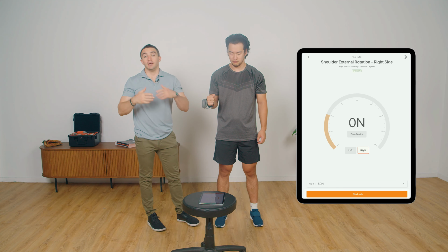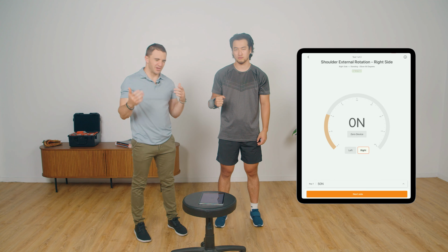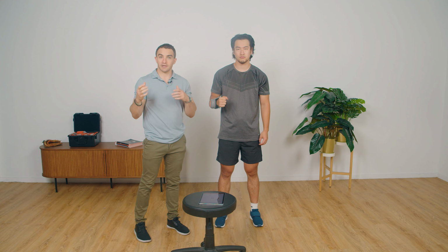Perfect. So in different circumstances, the load restriction may be different. It doesn't have to be 5 kilos, could be 3, could be more, could be less. But the idea is that a patient may not understand what it feels like to produce that amount of force that they've been prescribed. So using a dynamometer, we can give them an idea of how much force they're applying.